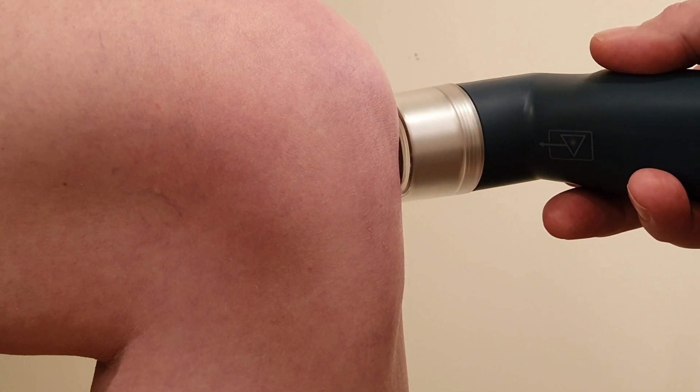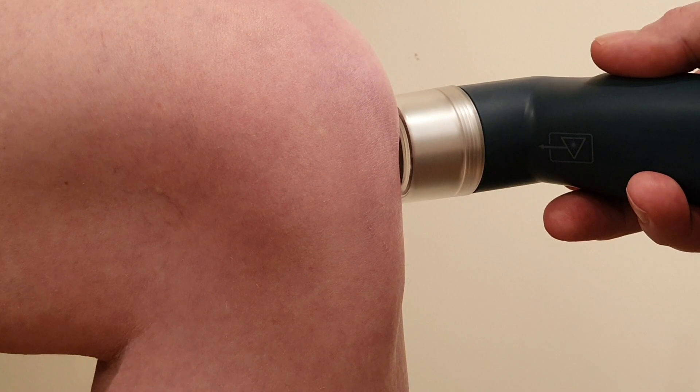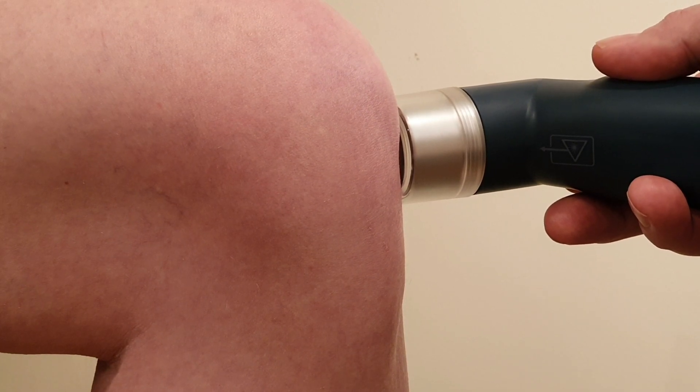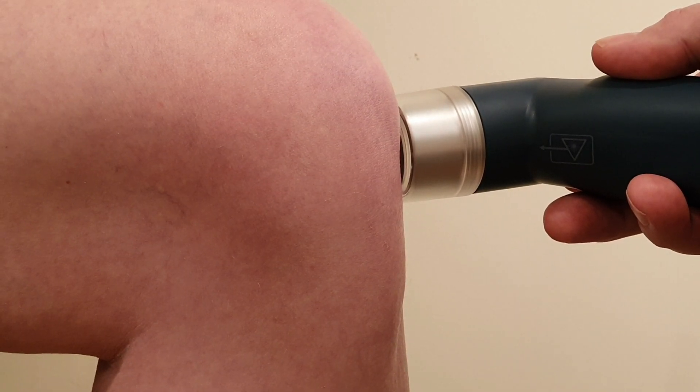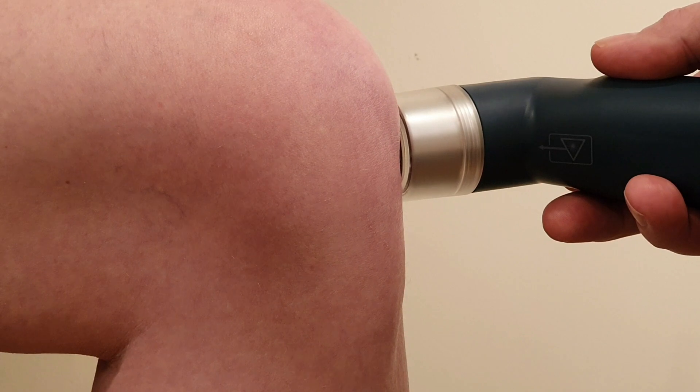I wouldn't keep the knee completely flat as you do this. You don't have to have it bent to 90 degrees as I do here, although that does really open out the joint a bit more. You can actually do it with the patient sat over the edge of the bed, which gives you the 90 degrees, and then you can sit on a chair in front of the patient to do the treatment. So that's the end of the treatment — as you can see, pretty quick.